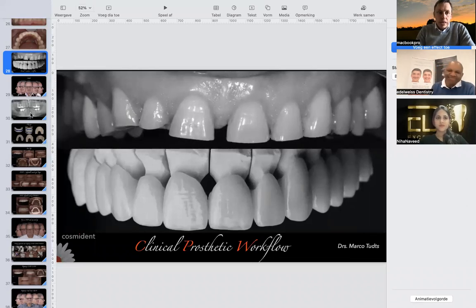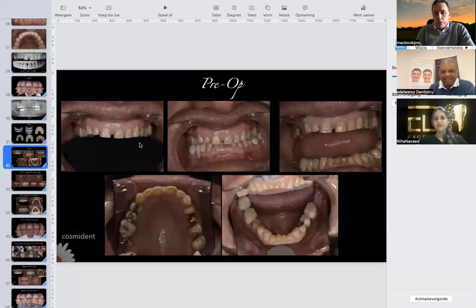And normally in a case like this, it's pretty easy to do that, because you always see some points where the enamel is still intact. If it's not intact, we try to do a CAD/CAM design in the smile design, and we add the material which we lost. On average, a front tooth is 1 centimeter or 10 millimeters. If you measure only 8 millimeters, I add 2 more millimeters. If you have 6 millimeters, I add 4 millimeters. And this is primarily how I start deciding how much material I want to add.